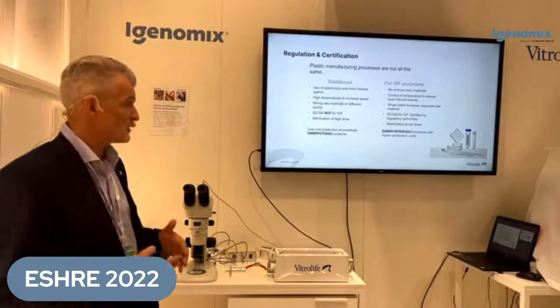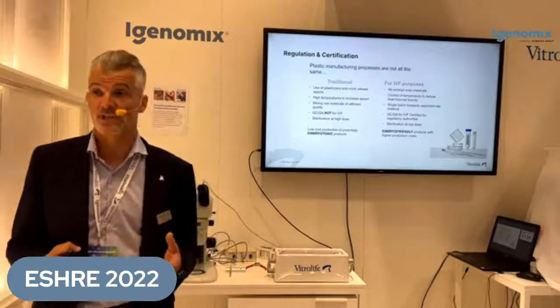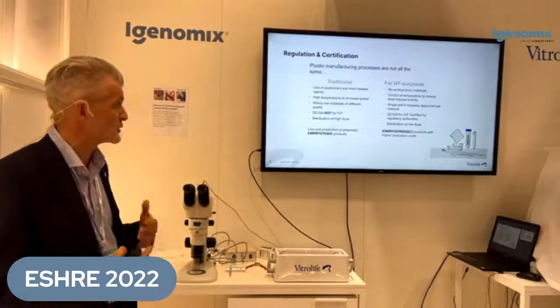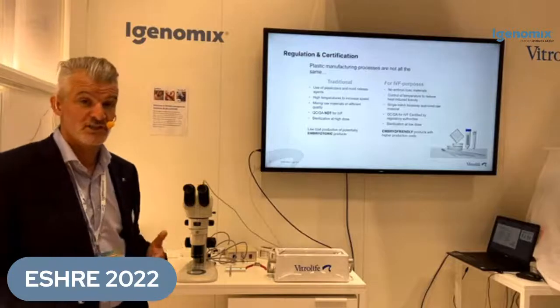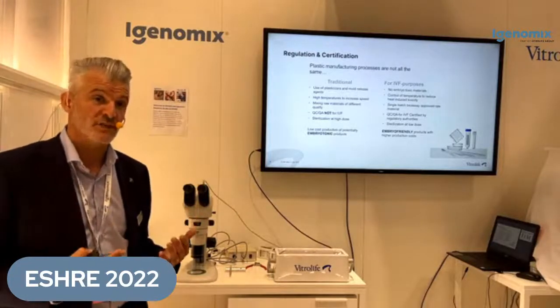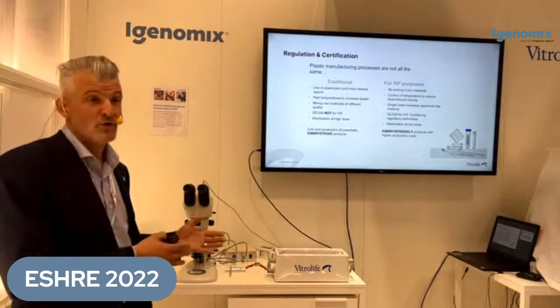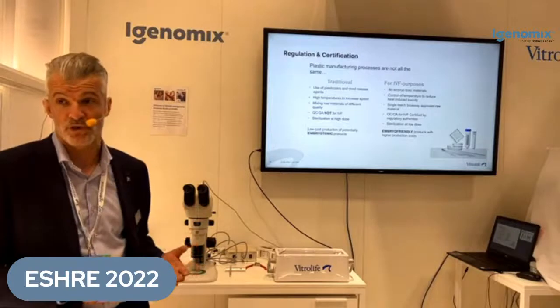Low-grade plastics, which are not intended for IVF use, would use plasticizers and mold release agents routinely in their manufacture. And these are often petroleum waxes, which we know can be embryotoxic. They'll use high temperature manufacture, which increases the speed and capacity of manufacture. They'll mix different raw materials of different quality, and they'll be sterilized at high dose. And this equates to a low cost production of high volume product, which is potentially embryotoxic.